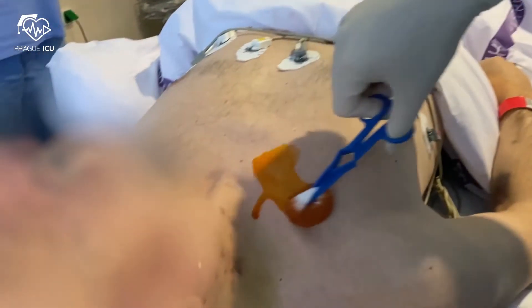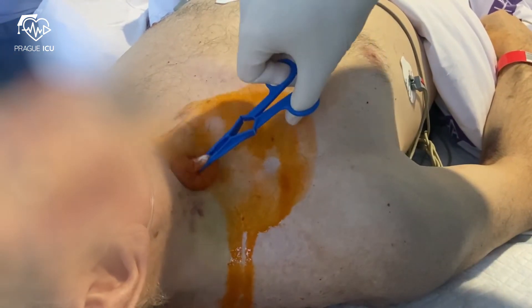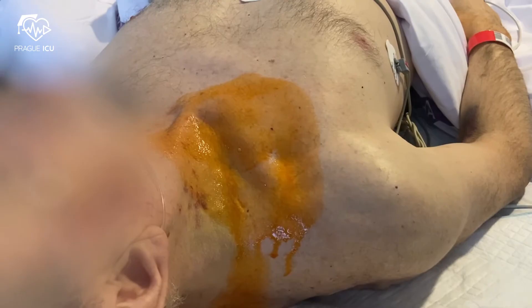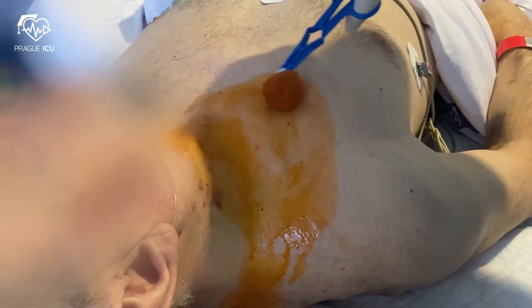We have shown a step-by-step approach on how to prepare a sterile trolley for cannulation in our previous videos, so we will directly proceed to the procedure. Place the patient in a supine position and prep the site extensively with chlorhexidine. Start from the center and move out.